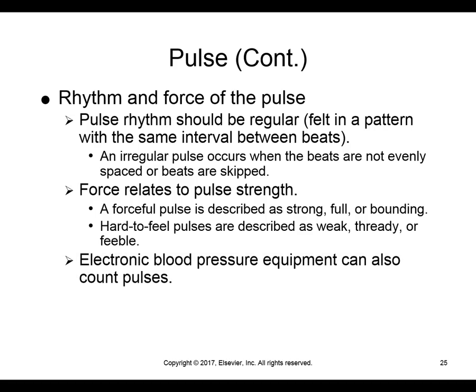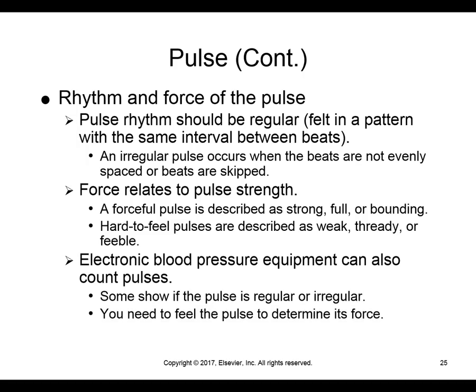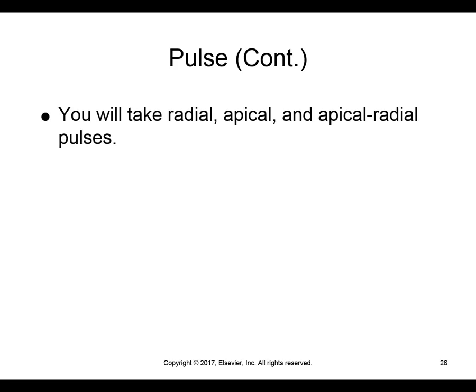Electronic blood pressure equipment can also be used to count pulses. When you get the blood pressure measurement on an electronic device, it will have the pulse measurement. Some will show if the pulse is regular or irregular, but many of them will not. So it's important that you also feel the pulse to be able to report whether it was regular or irregular. And you need to be able to feel it to determine what its force is. So using an electronic device doesn't mean that you don't have to feel the pulse, okay? You still have to feel the radial pulse.